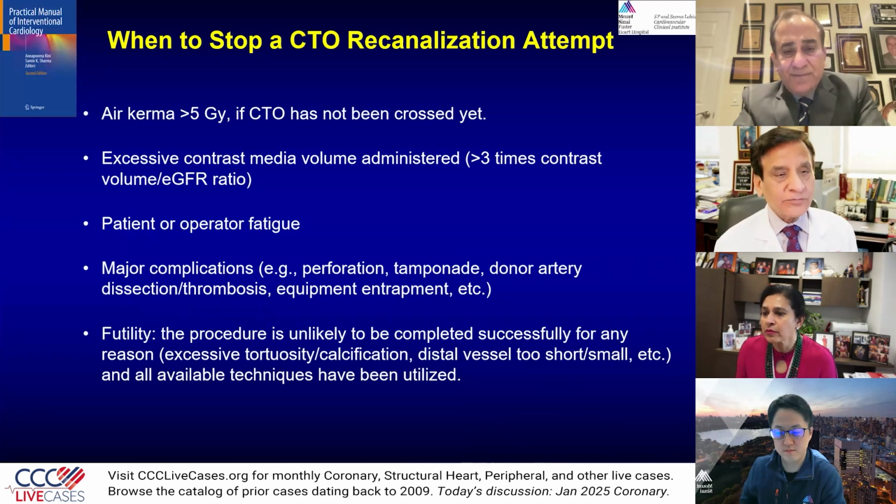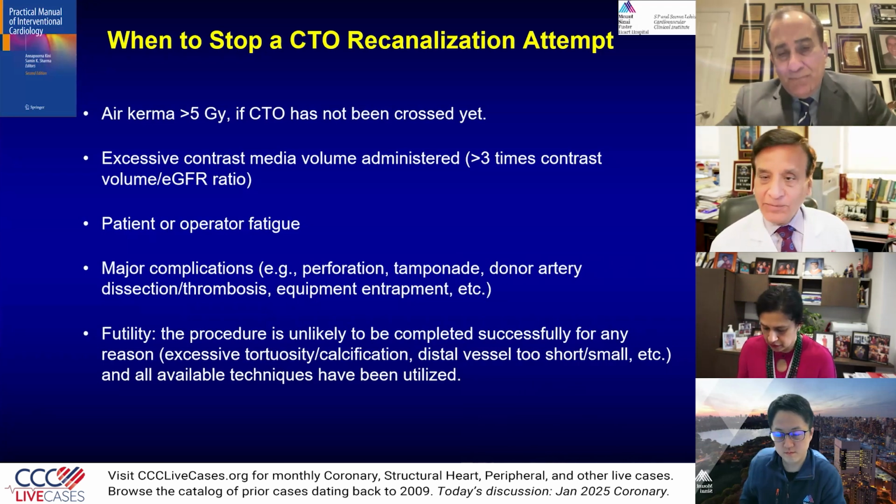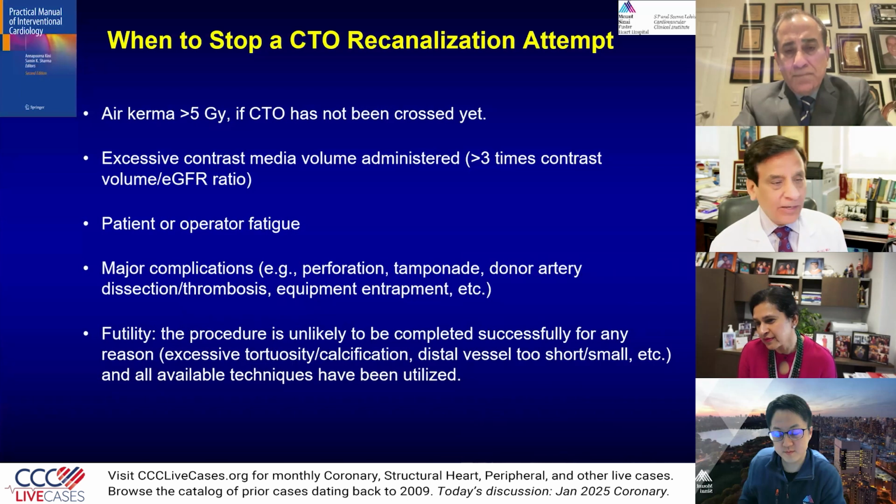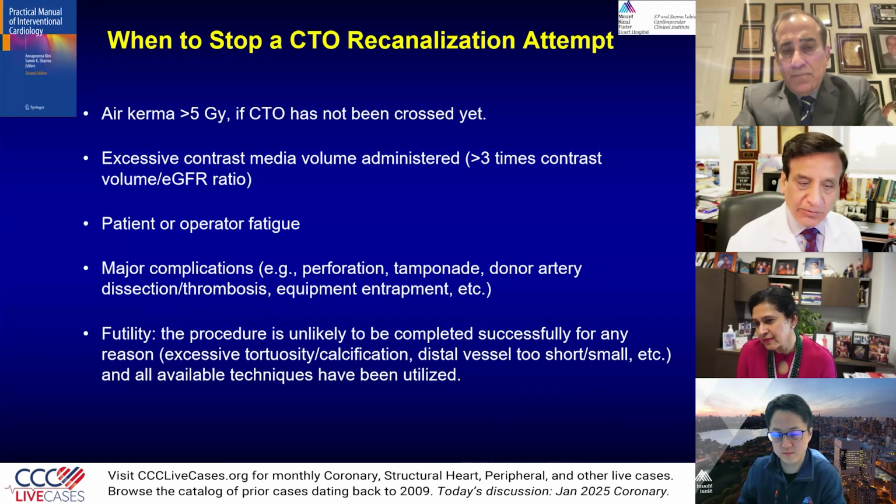Sameen, go ahead, please. One last question, and I don't know whether it was sarcastic or a compliment. So I think we should talk about, let's say, how not to do a CTO PCI. I expect this question referred to the fact that we do not do more antegrade dissection, which is associated with higher restenosis and occlusion and lower stent patency, and so on and so forth.